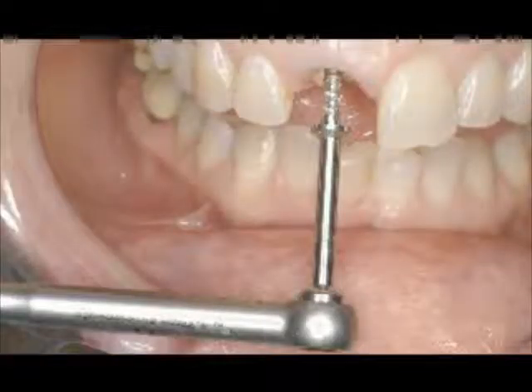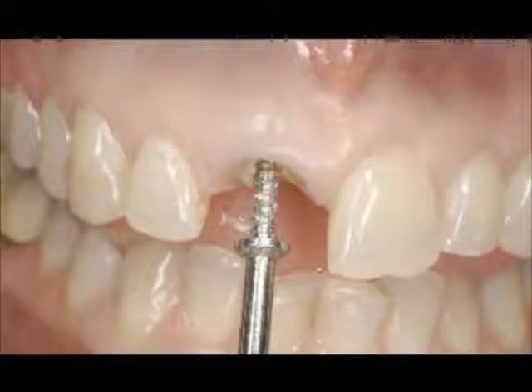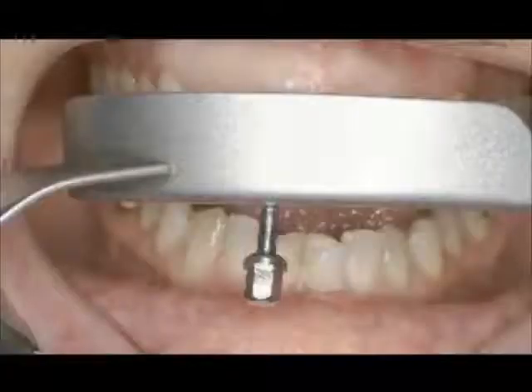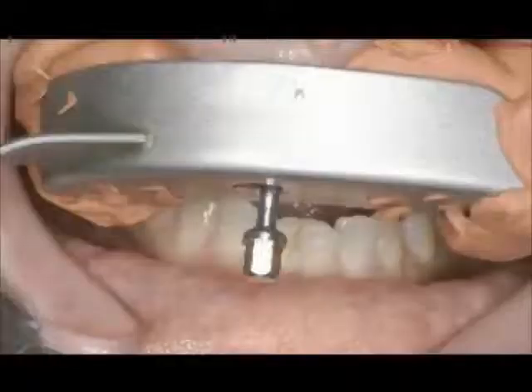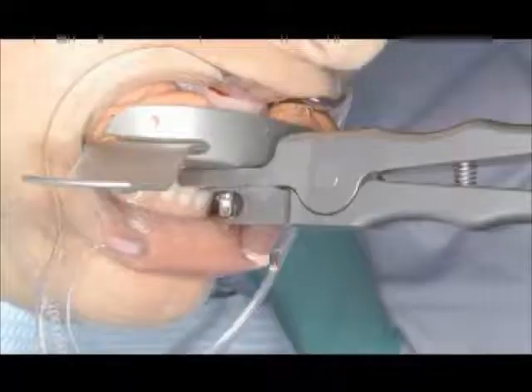We actually drill into the root canal system, and then much like we place an implant, we use a self-tapping extraction screw placed into the remaining tooth structure that is subcrestal, and then we fit an extraction tray on with thick putty mix to protect the adjacent teeth while we then apply the extraction forceps. And what you're seeing here is the delineation and space underneath the gingiva and the line for the extraction forceps.